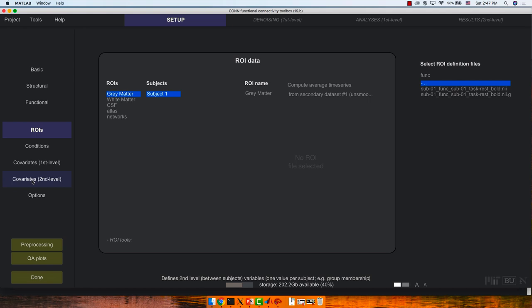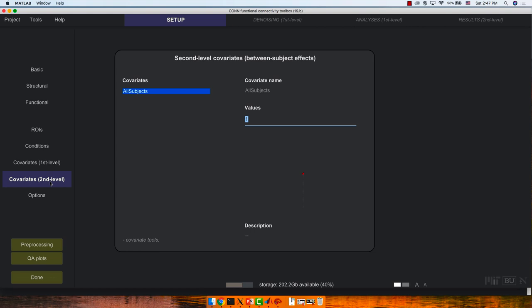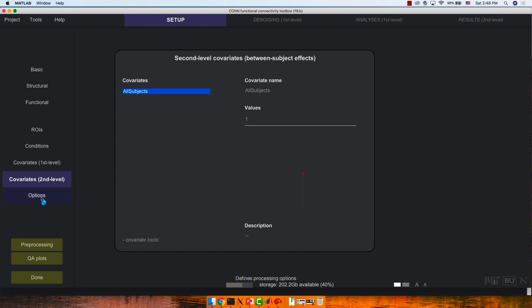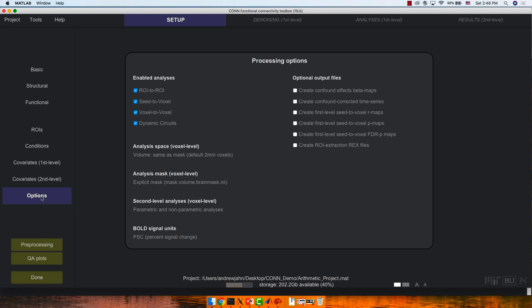Second-level covariates are for group-level analysis. Once you run your entire analysis, if you want to do another type of contrast or add another covariate, you need to come back here and enter it, then go back to the results section. Everything else is pretty linear — you need to do one thing before you can do the next. You'll also notice that the Denoising, Analyses, and Results tabs are all grayed out because you need to do preprocessing first.